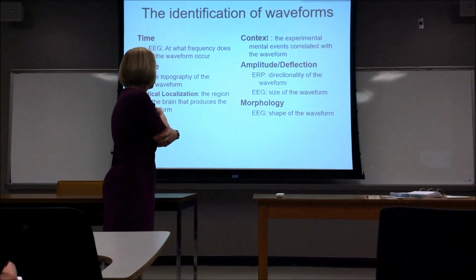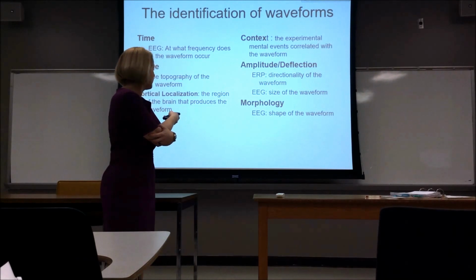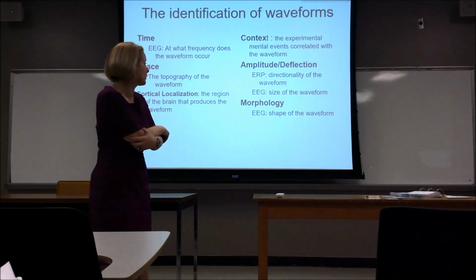ERP is an electroencephalographic waveform, and ERP stands for evoked potential or event-related potential.